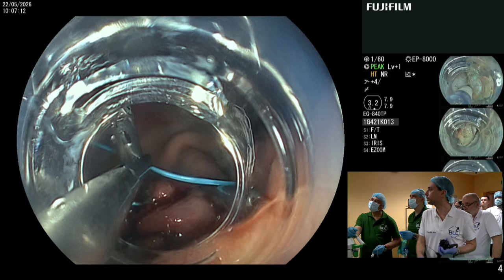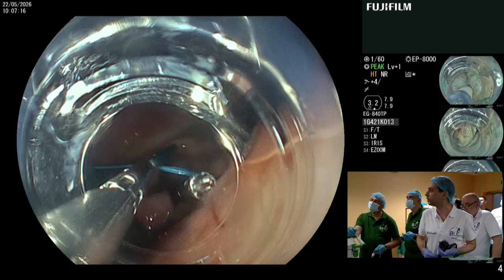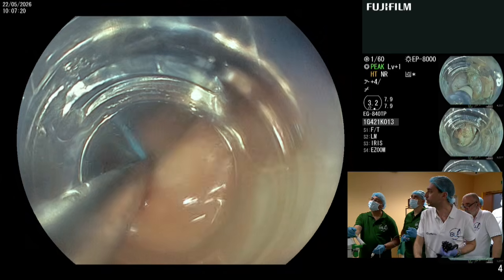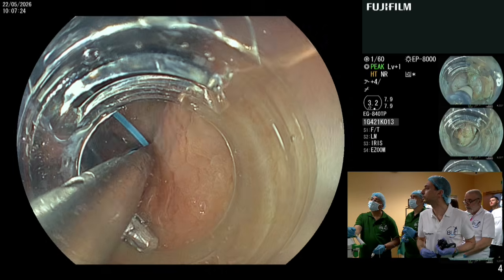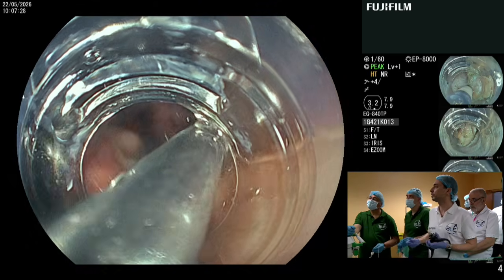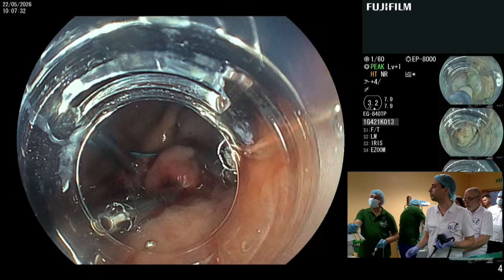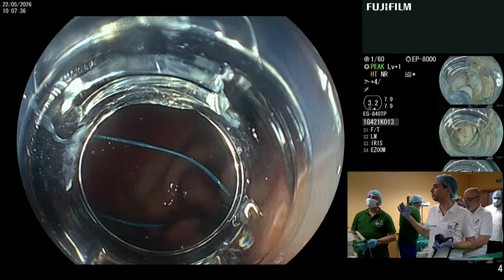Please, grasp the endoloop. Grasp the endoloop. Not the clip, open. Yes, close, all right. I will place it here. Open. Close. Place, fire. Okay. Next. Yes, all right, that's good. Next clip. Prepare many clips, please.